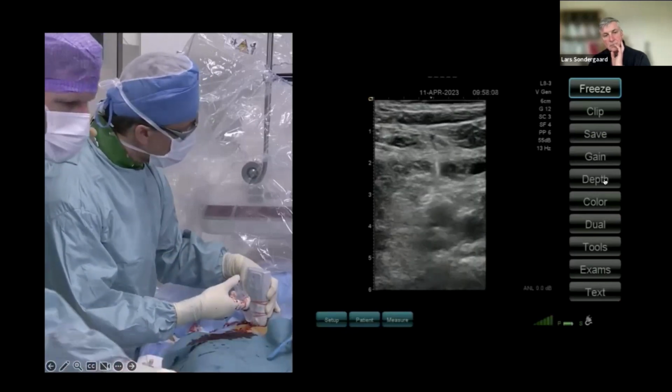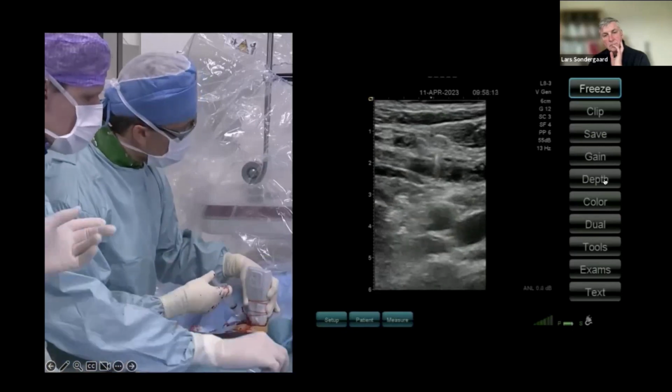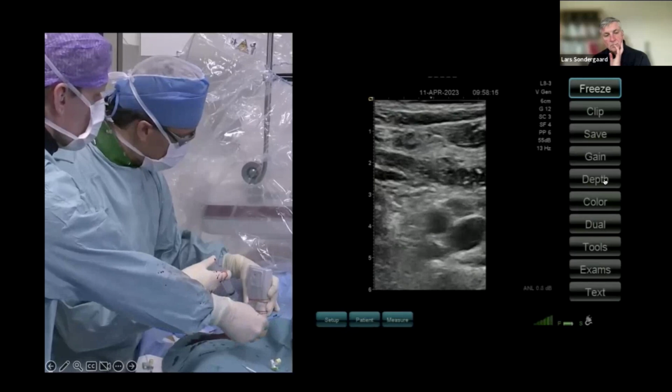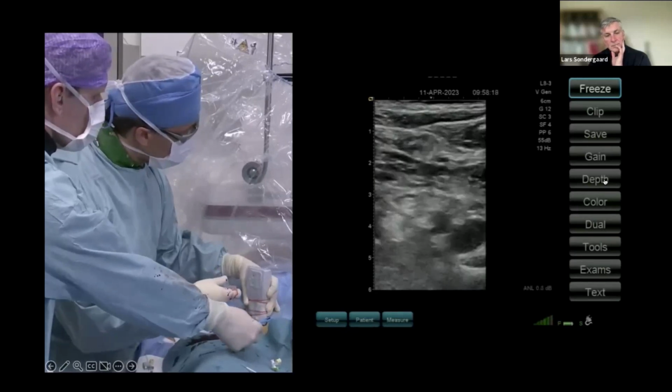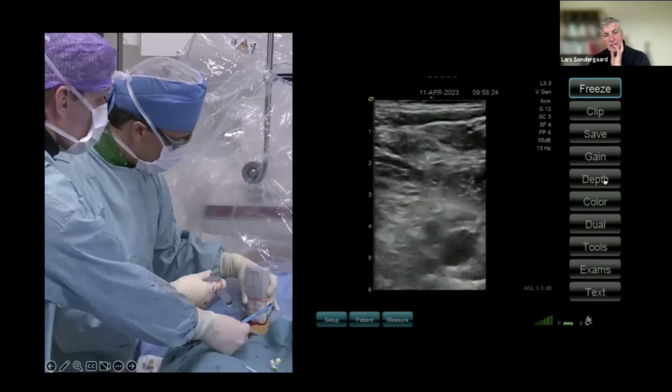What I'm doing now is also administering local anesthetic while looking at the echo, because then I hope we can do it more precisely, as was rightfully commented. And we can see that we're on the roof of the vessel, so hopefully right in the center. Okay.